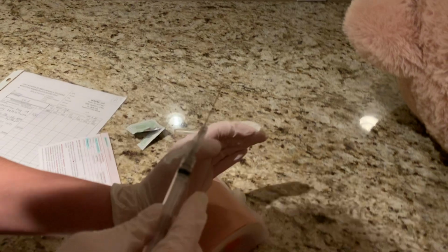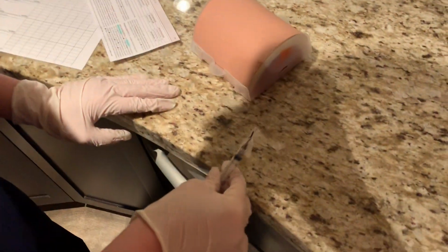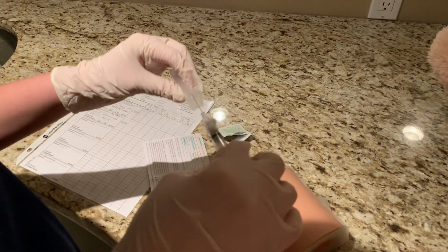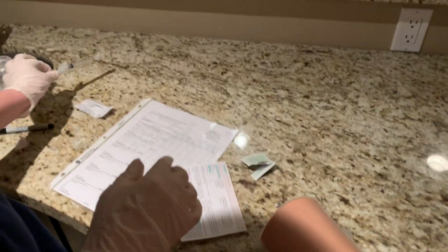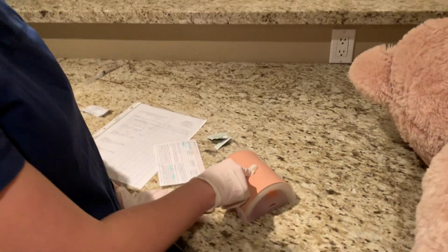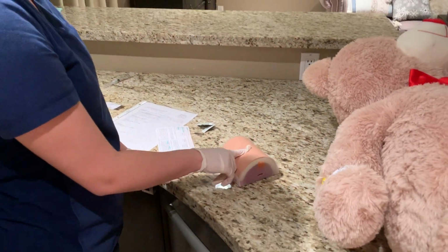Once that's done, I will take out the needle and release my hand. I would activate the needle, and then I would put it in the sharps container. For now, I'm just going to put the cap on, even though we wouldn't do that in real life. If I had a cotton swab, I would hold it to the site for a few seconds.